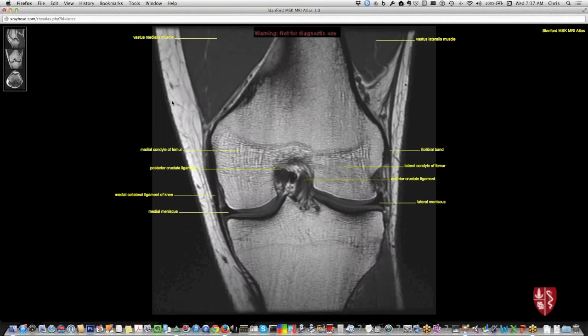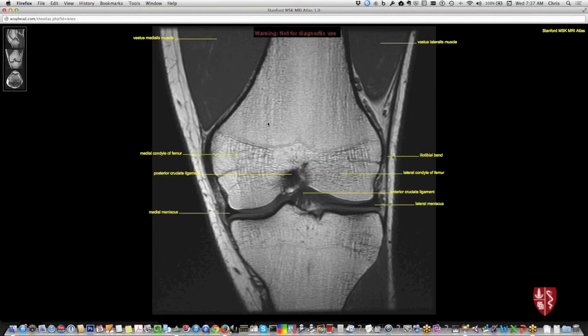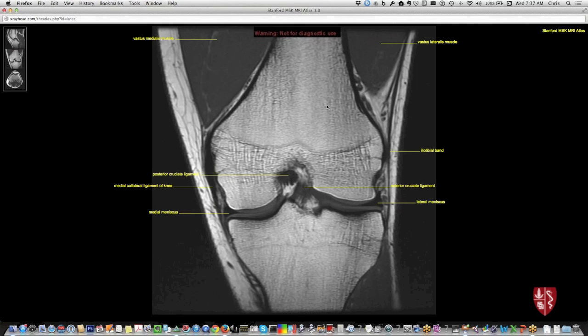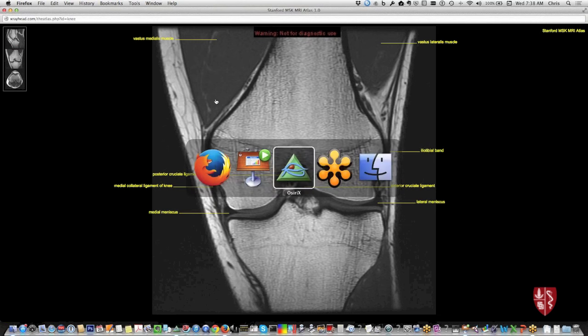My approach has typically been to go through the coronal scans systematically, then move to sagittal, then axial. The rationale is that I don't like jumping around between different series — I prefer to focus on one imaging plane, then go to the next to reinforce that information. The final plane can show things not visible on the first two, helping to refine and finish up the case.